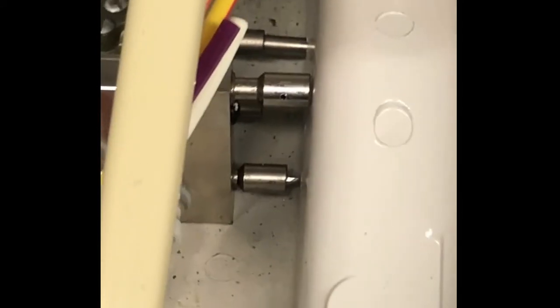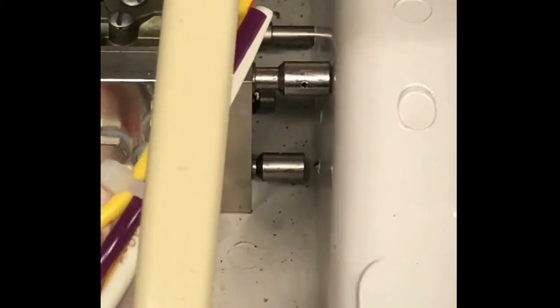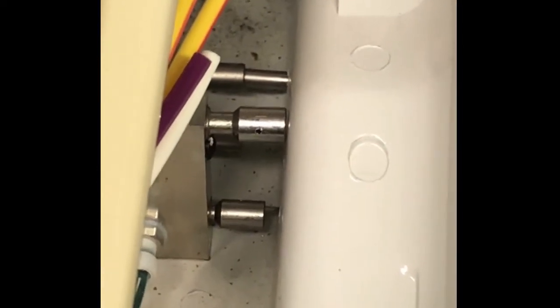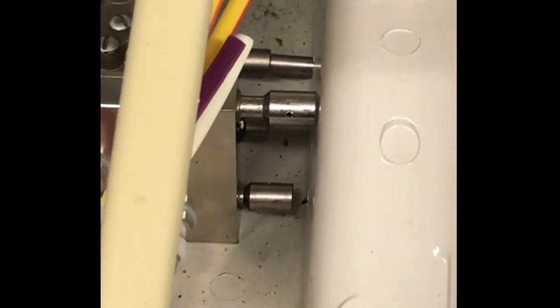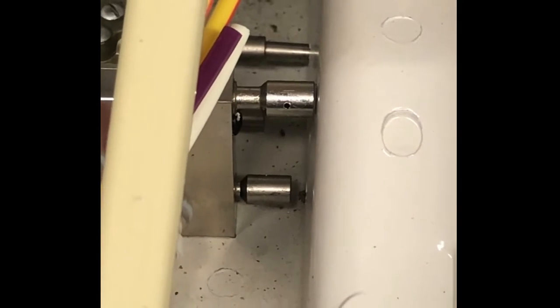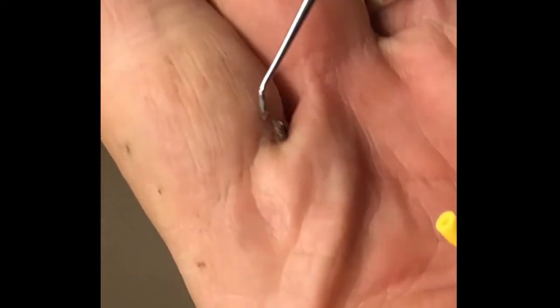All right, and literally, I don't think it's bad if you see me struggle with this, because I'm literally not working with any light. I can't see, but even without light, I got it out, okay? So boom, that's the piece that just came out, so we just got the O-ring out.